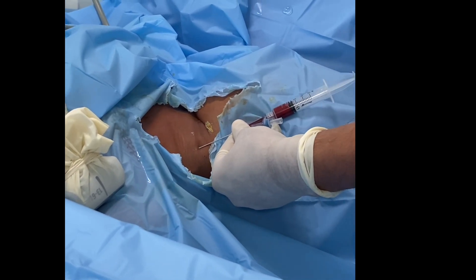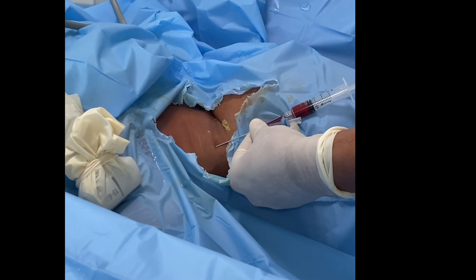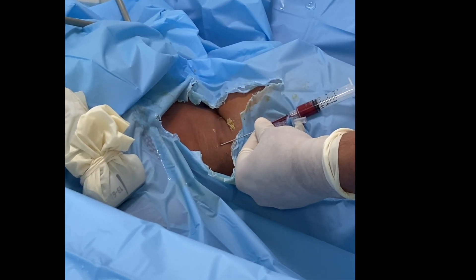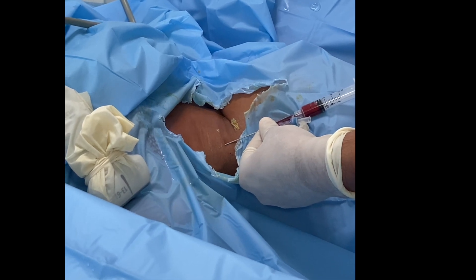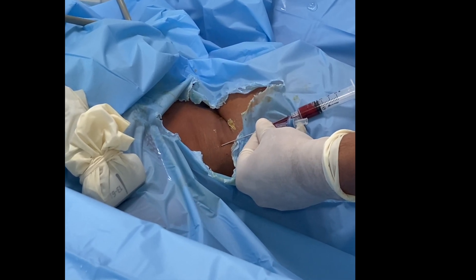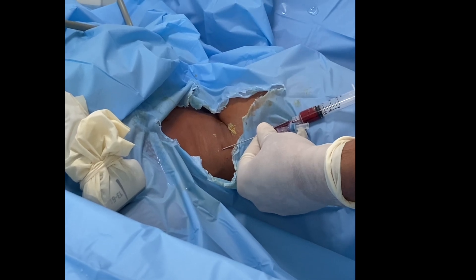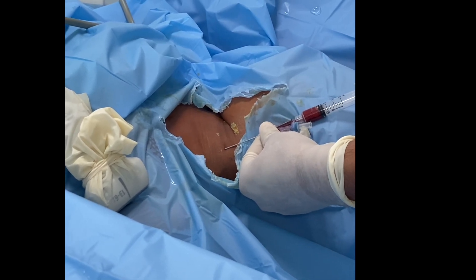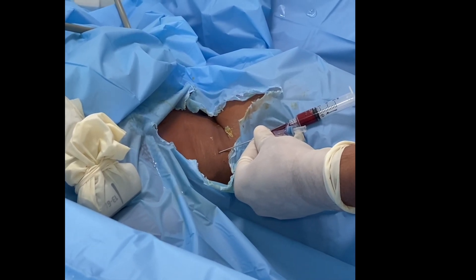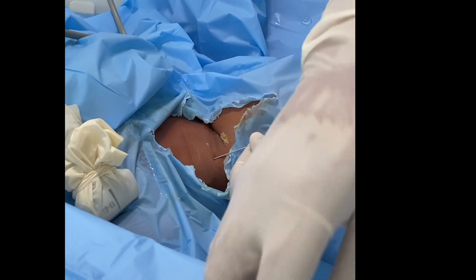Always look for the needle tip so that you can prevent the carotid puncture as well.